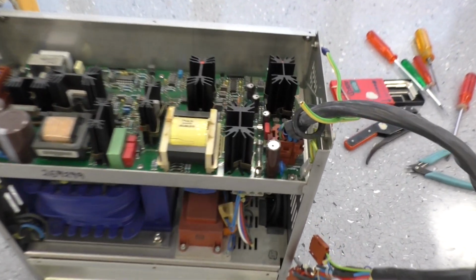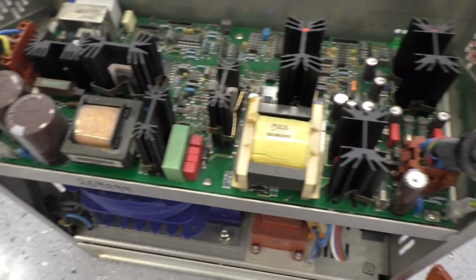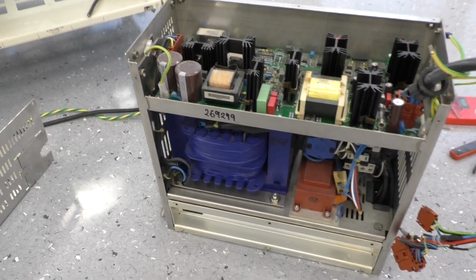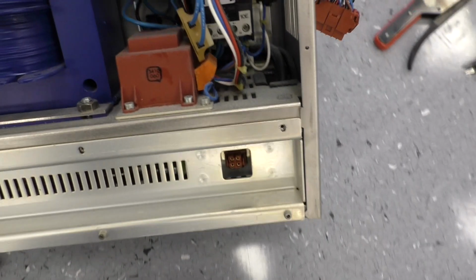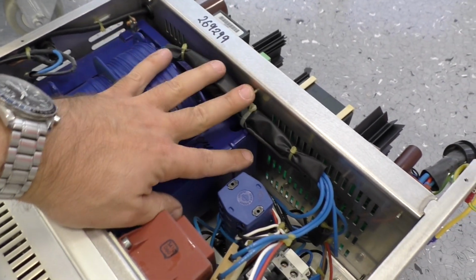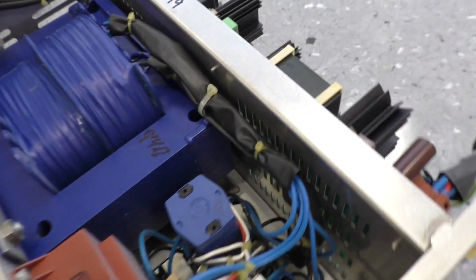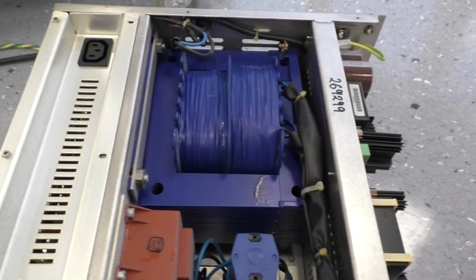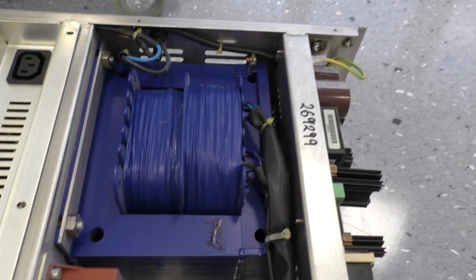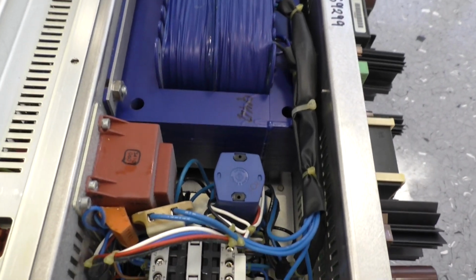Okay, that's it. Power supply, input capacitors, transformers, all the usual stuff, and we have a big blue transformer. That's heavy. Compare it with my hand, that's a big one, and I'm sure it has this blue color because it's medical approved, 1000% safe and extremely expensive.